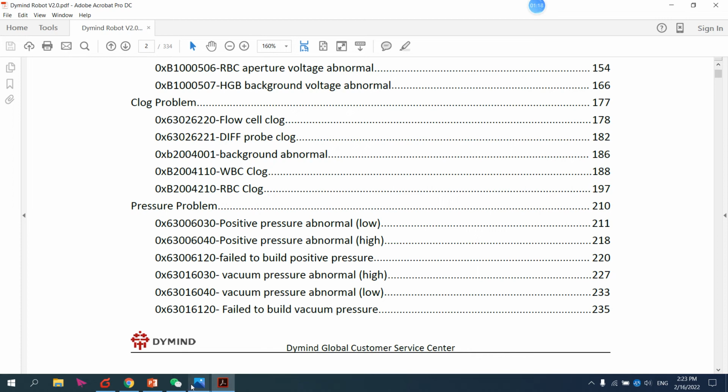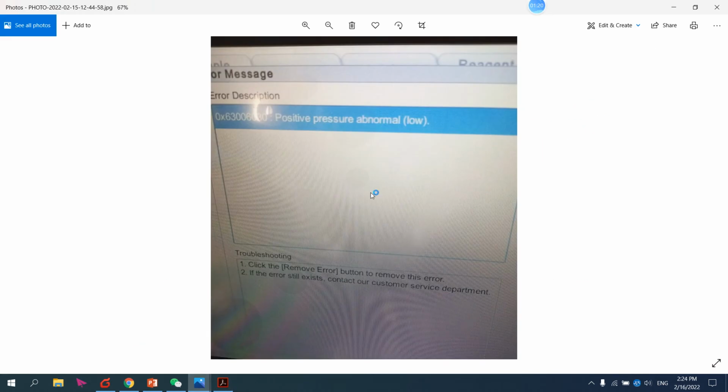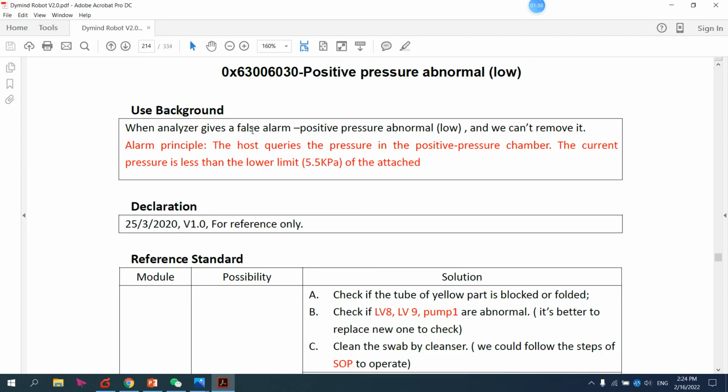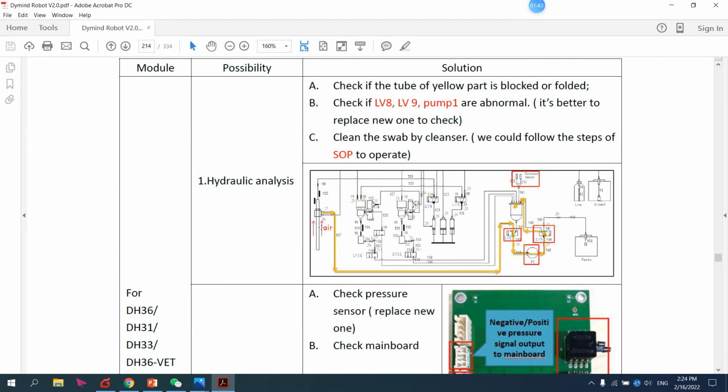So here, the problem is positive pressure abnormal low. The solution is here, positive pressure abnormal low. Just click on this one. Also, you know, the solution is on page number 211, or just click on this. Now I'm entering here, positive pressure abnormal low. So here is the solution.